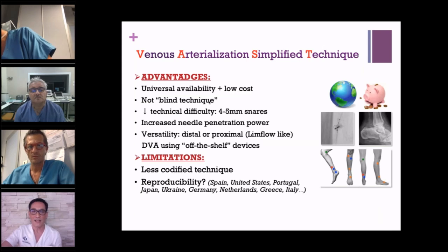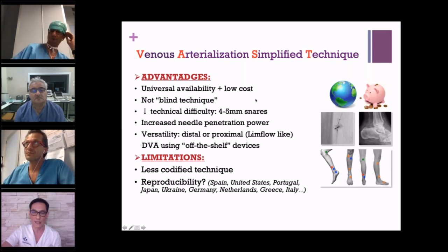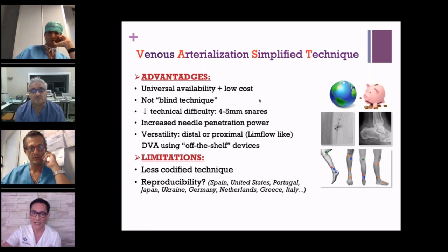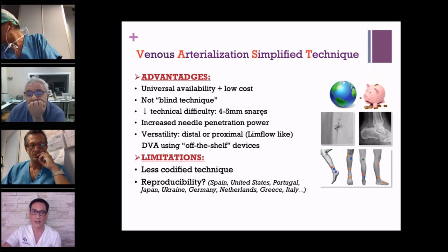What are the main advantages of the VAS technique? I would say that the main advantage is the universal availability and the low cost. This is no longer a blind technique, and this overcomes the 20% failure rate of Gandini's technique. The technical difficulty is fairly low if you have minimal experience in retrograde puncture of distal vessels. And when you are dealing with calcified vessels, the needle penetration power is increased.